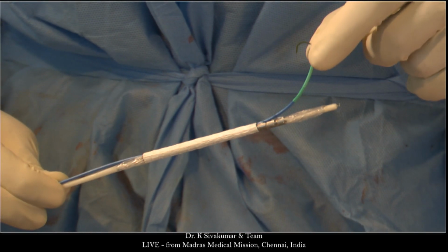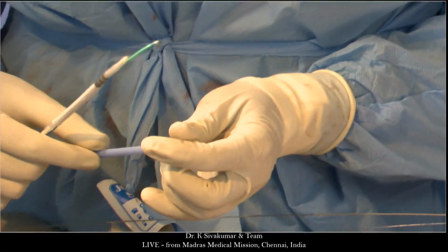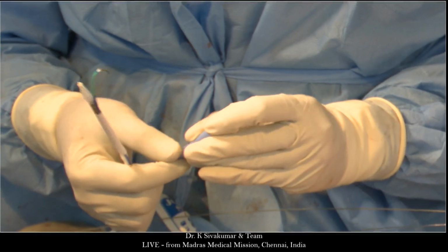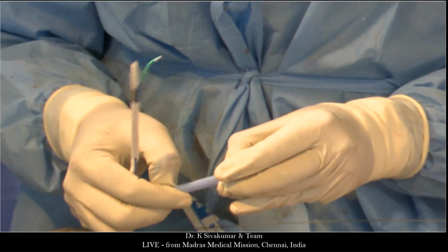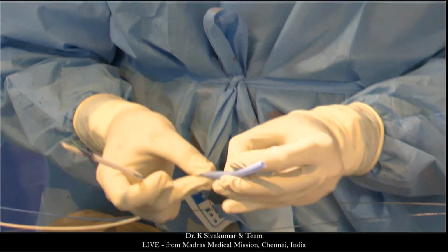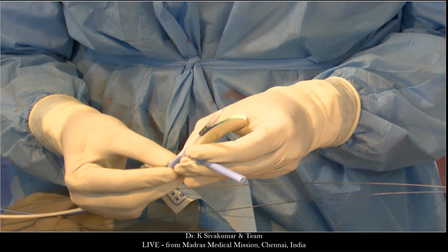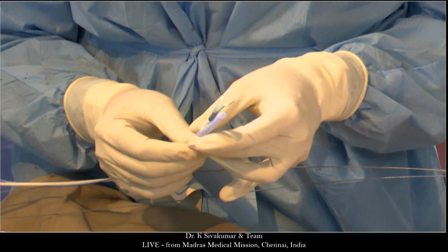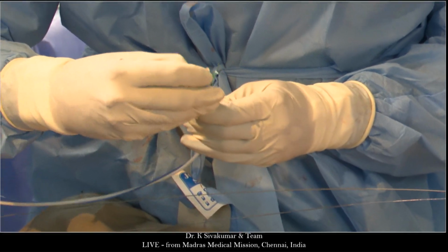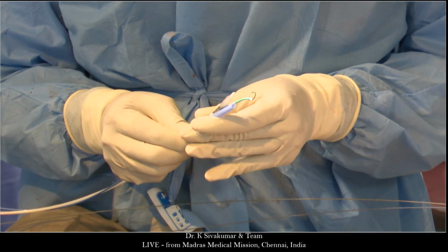Yes, sure. So right now what I'm going to do is, I need a protective sleeve. So I have taken an 18 French sleeve. I have slit it longitudinally. Now I'm going to cover it. Can you see that? I'm slitting it, because this is now going to be much larger in its profile than what I anticipate.